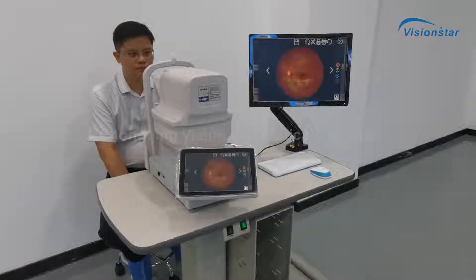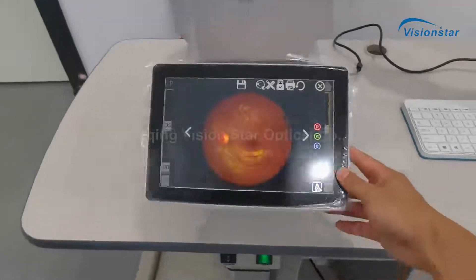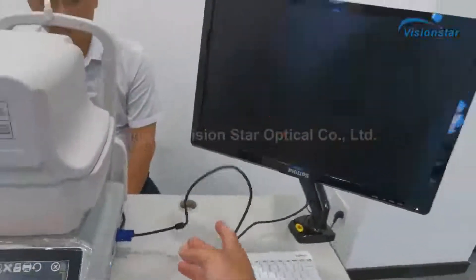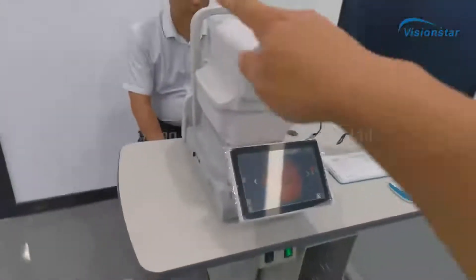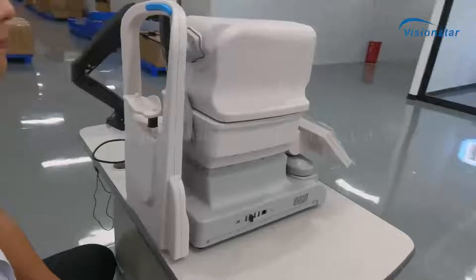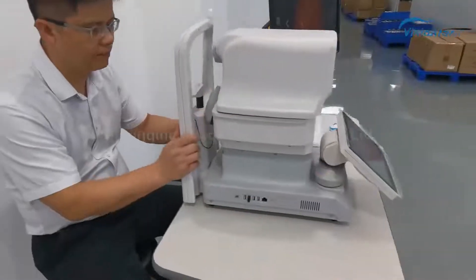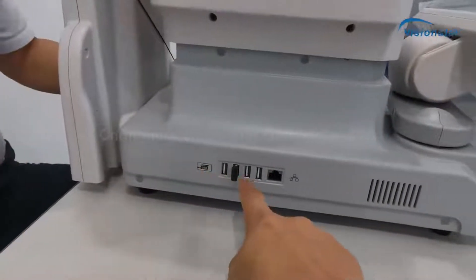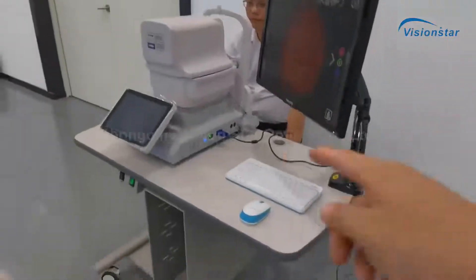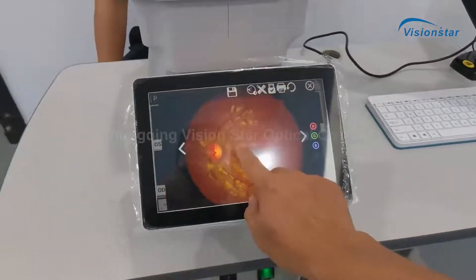Hello, this is our fundus camera — a fully automatic fundus camera. This is a monitor for the device. You can also connect to a bigger monitor to show the image. This is our engineer Jack for after-sales services. You can see the appearance of the device. This is a motorized chin rest, this is a USB port and a network port, this is a keyboard. You can use the keyboard or just use the touch screen.